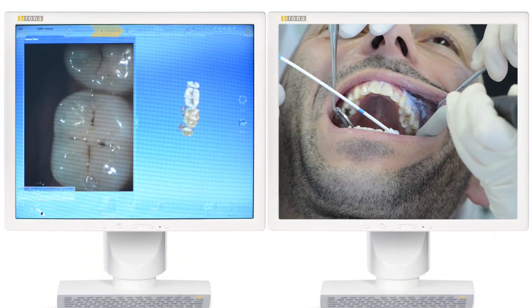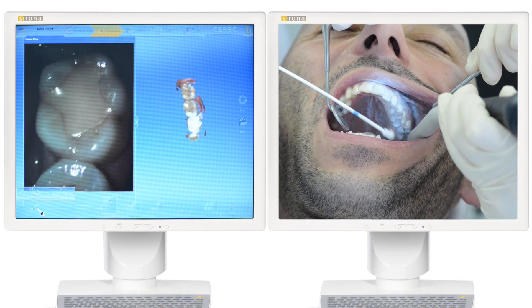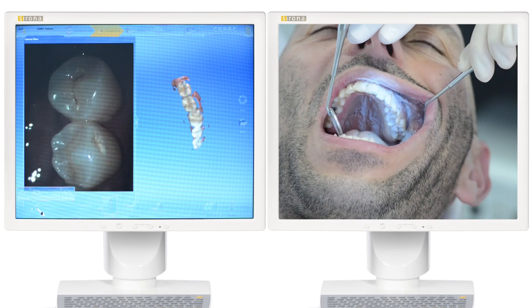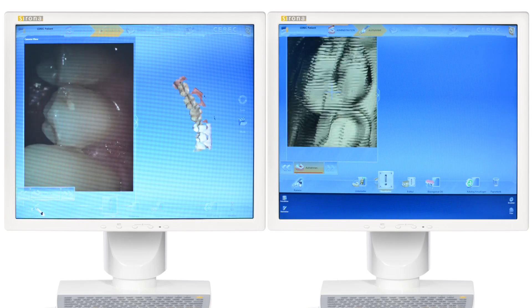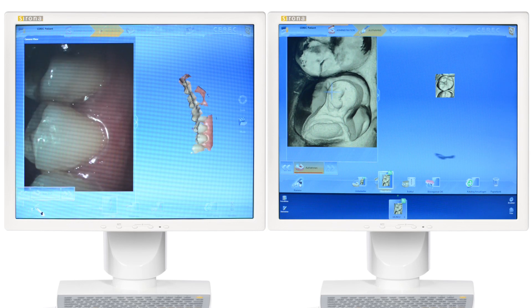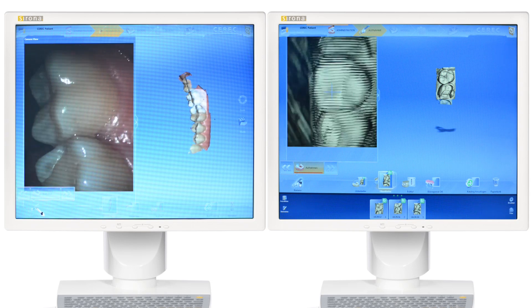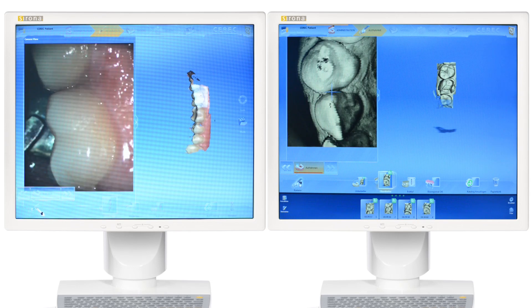In direct comparison, the BlueCam is convincing with its speed in single tooth restorations, despite requiring powder. OmniCam, being powder free, inspires with a continuous flowing scan process and 3D images in natural color.